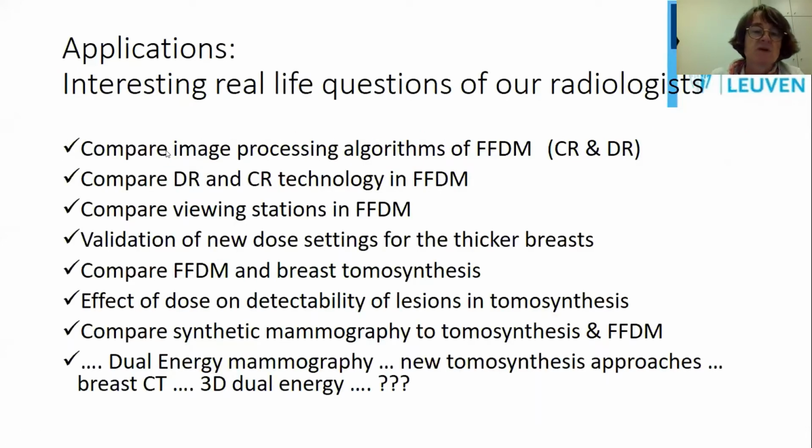For instance, the one I started with, it's historical also, so it all started with this: can you say something on the quality of the image processing algorithms that are being invented and brought into the market for 2D mammography, both for CR and DR applications? Can we compare DR and CR technology for 2D mammography? Can we compare the quality of the viewing stations? How about a new dose setting for the breasts?